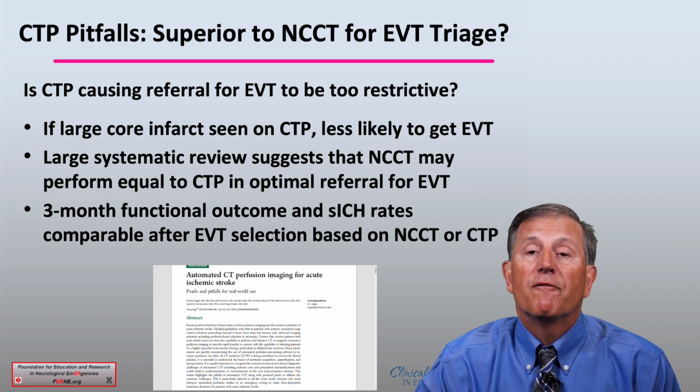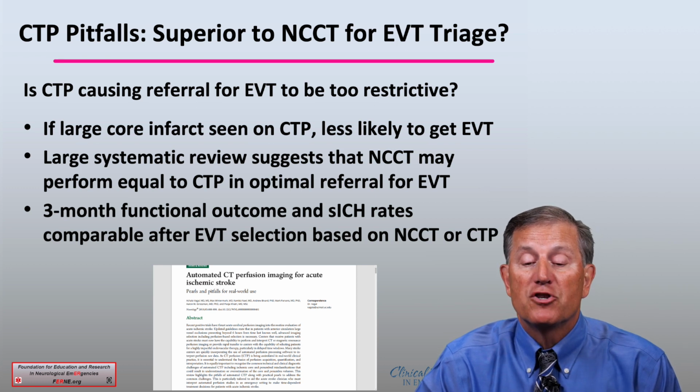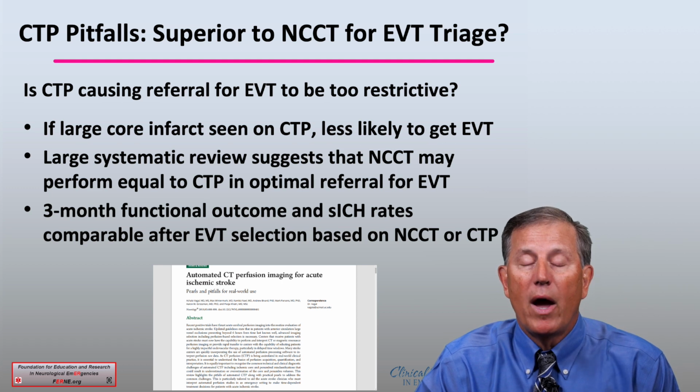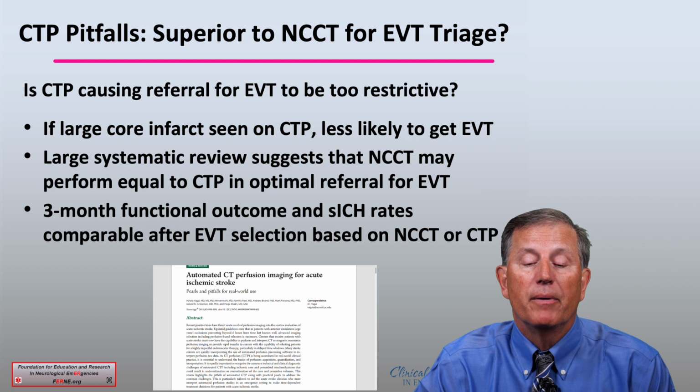We know that if a large core infarct is seen on CT perfusion, the patient is less likely to get EVT. And although this is likely the right way to approach patient treatment, it may be that we are restricting the number of patients who should go for EV therapy.